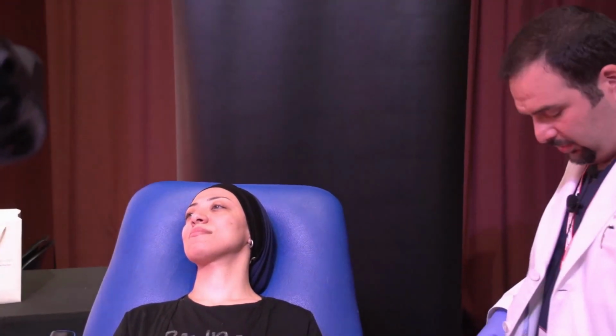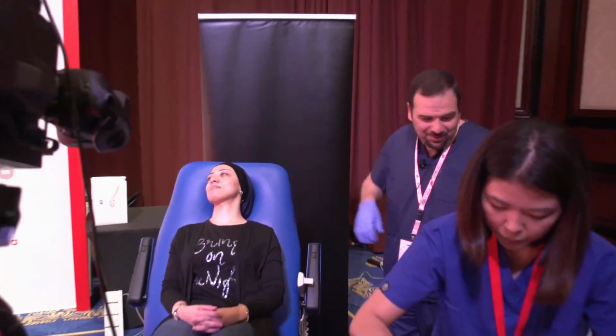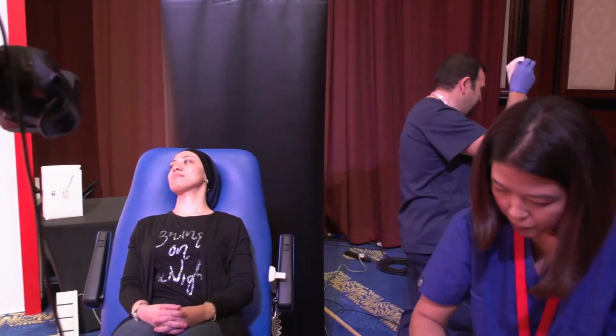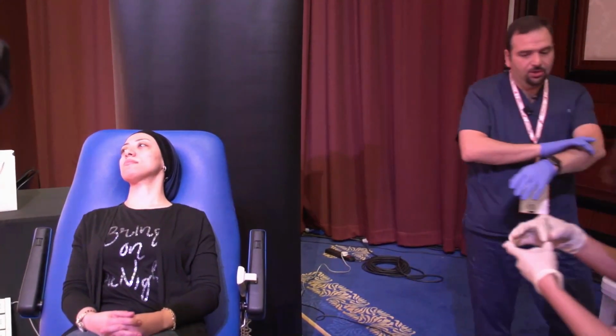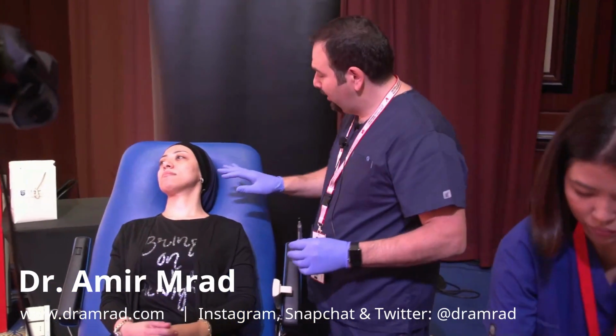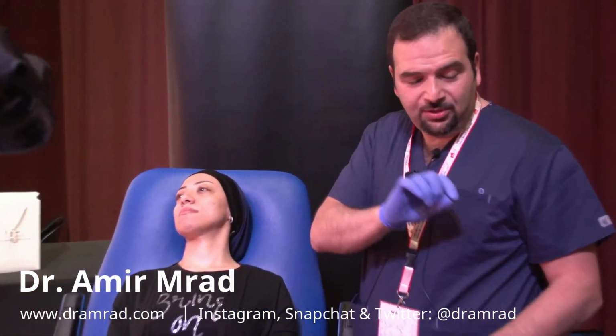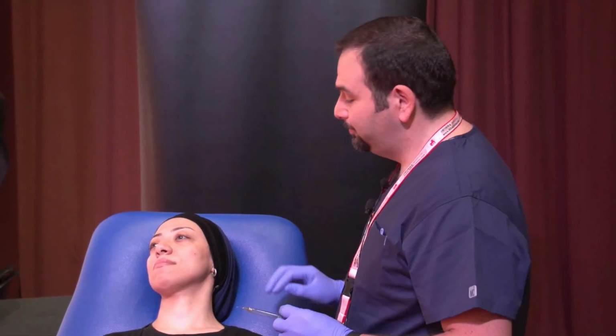I've worn the lab coat and the scrub suit today to demonstrate that as well. I removed that before the treatment. I just forgot. Very anxious. You don't want to transmit infections with your gloves. I've sterilized the area already. I have alcohol swab all around me, and she's ready with alcohol swab as well. That area hasn't been touched again.